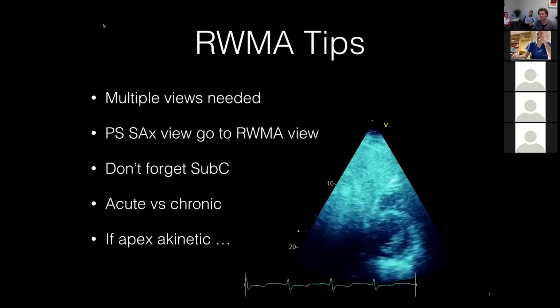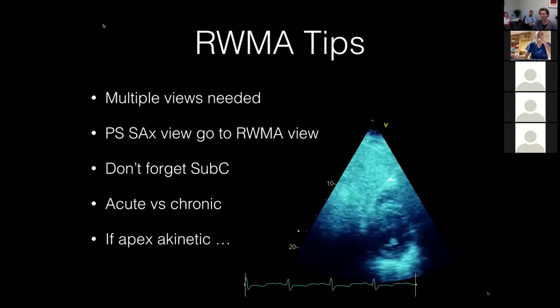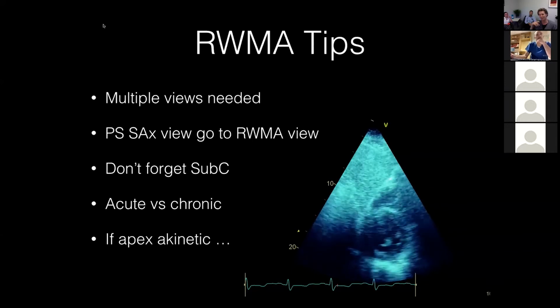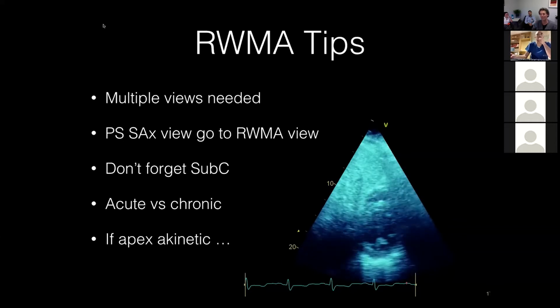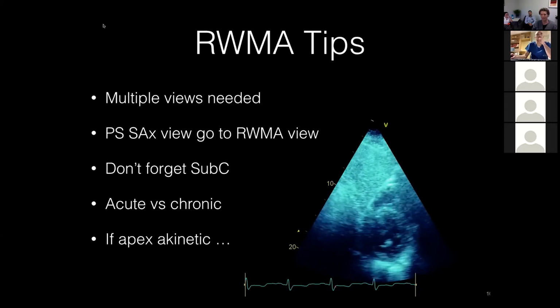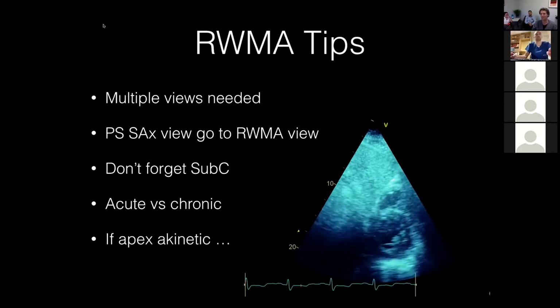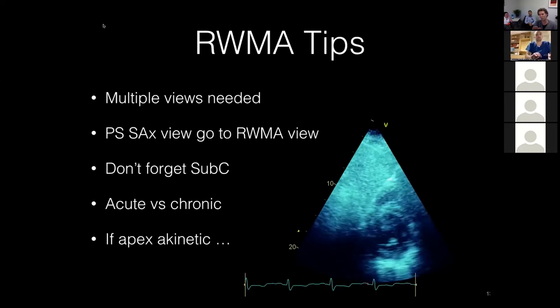And I learned all of this from our wonderful sonographer here at Nepean called Jenny, who's the queen of subcostal views, and she can do the most incredible amount of analysis from that. This would be an example of how to do it, where you're subcostal, and then you just rotate your probe around and look to the patient's left, and you can get pretty decent short axis views if you're lucky. Including this, you can also get analysis via RVOT sometimes, and even a tricuspid valve. So don't forget the subcostal view for your 4-chamber view, but also for your short axis.